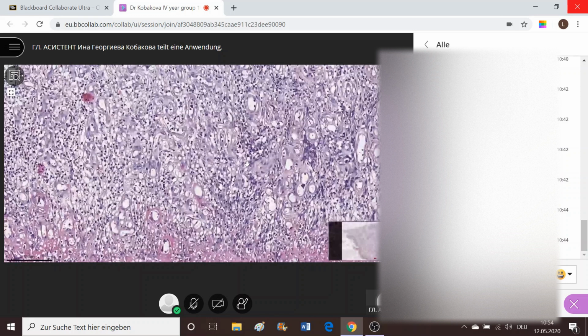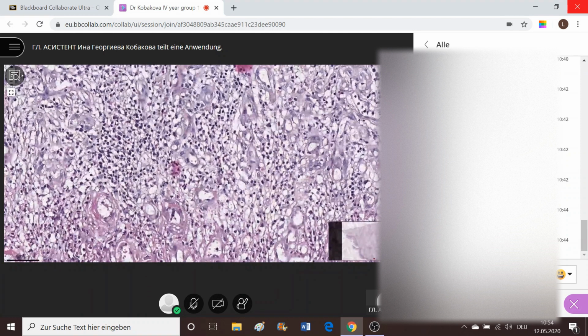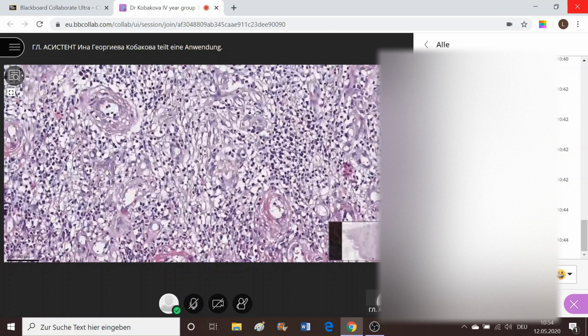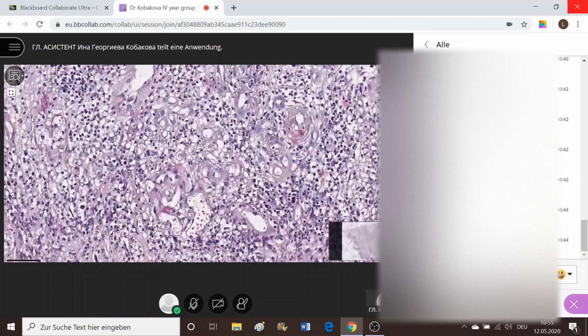All these blue dots are actually lymphocytes. And epithelioid cells or macrophages should be observed here and there, like here, here, also here, a huge field of these, also here. These are the macrophages, which are with a little bit more transparent nucleus, larger, and the cell itself is much larger than the lymphocyte itself, which should be as large as an erythrocyte. Take a look at the bluish dots and reddish dots, they're pretty much the same size. This is marked as cervical erosion.